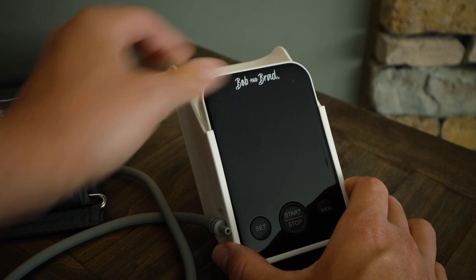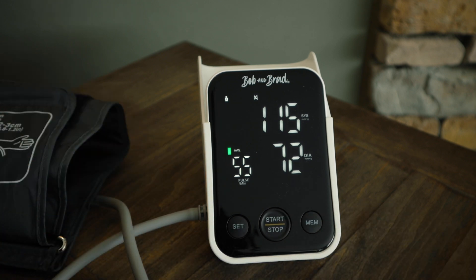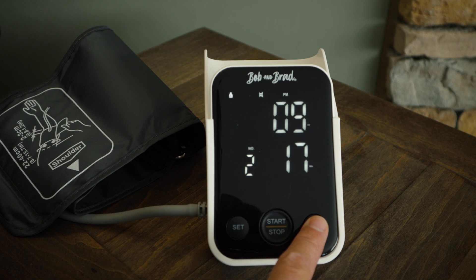Taking your blood pressure at home is actually a really accurate way to monitor your numbers because you can be in a relaxed, comfortable environment and compare data over multiple days and times. Plus it's a great way to track your data so your provider can see what your blood pressure is over time, instead of just relying on one measurement taken in their office once or twice a year. Using a monitor like this is really pretty simple, but always make sure to read the instructions provided with the unit.